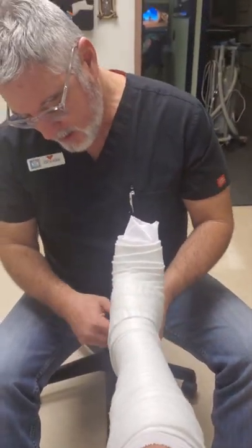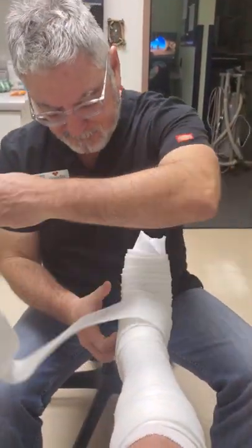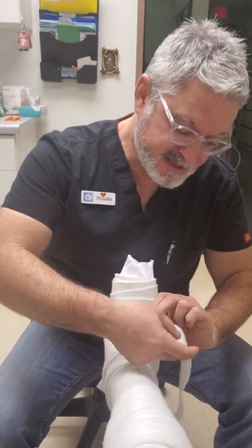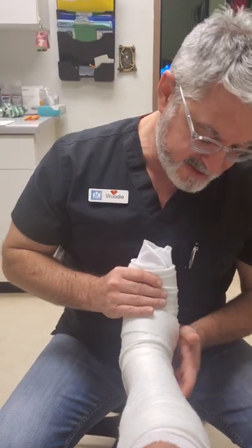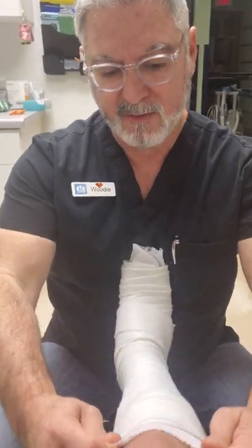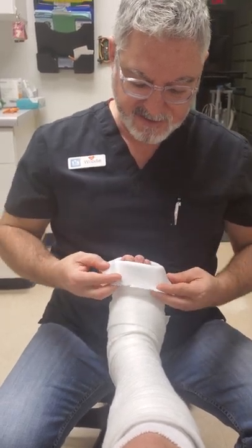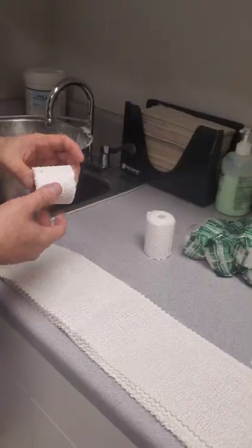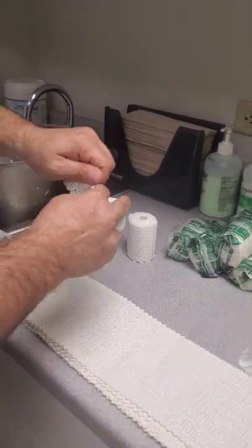As you can see, we've pretty much padded up the leg and the foot like you normally would with the cotton padding. I'm just finishing up here, and what we're going to do is move on to the plaster as opposed to the fiberglass. I just wanted you guys to get a nice little glimpse of how we wrapped up the leg with the cotton padding the way we normally do, and again we're going to fold it over and make it look just like a traditional cast.